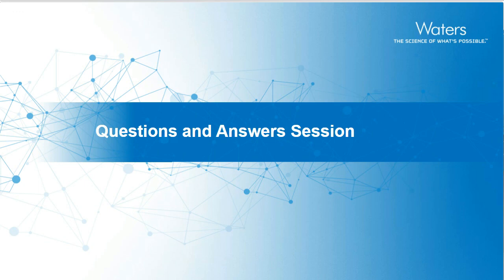Another couple of questions on the RADIAN. How does the system cope with a high concentration sample that suffers from contamination? So I've run samples which were high concentration, and as it showed in the presentation, you get the error message saying that you've got saturated scans. But I've never seen any contamination of the instrument or carryover into the samples that are run after samples that do become saturated.